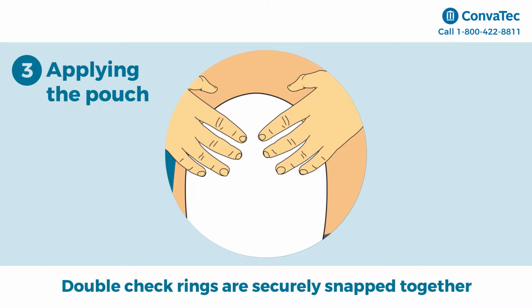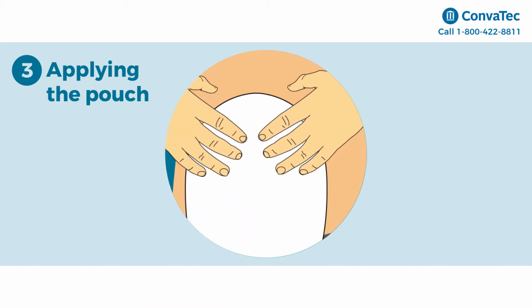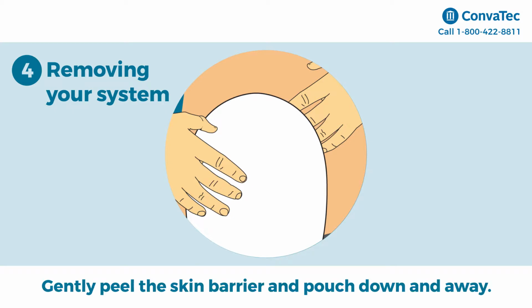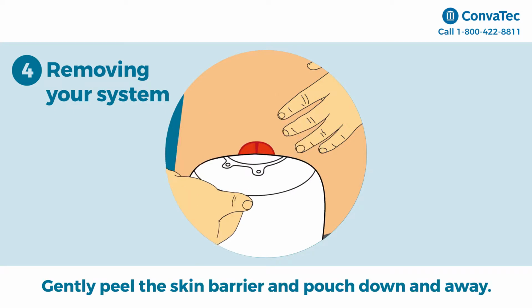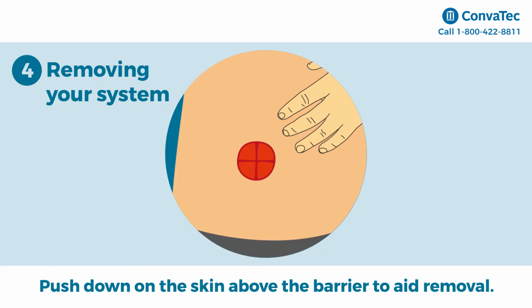Double-check rings are securely snapped together by pressing all the way around the rings a second time. Step 4. Removing the pouch. Using one hand, gently peel the skin barrier and pouch down and away. With the other hand, push down on the skin above the barrier to aid removal.